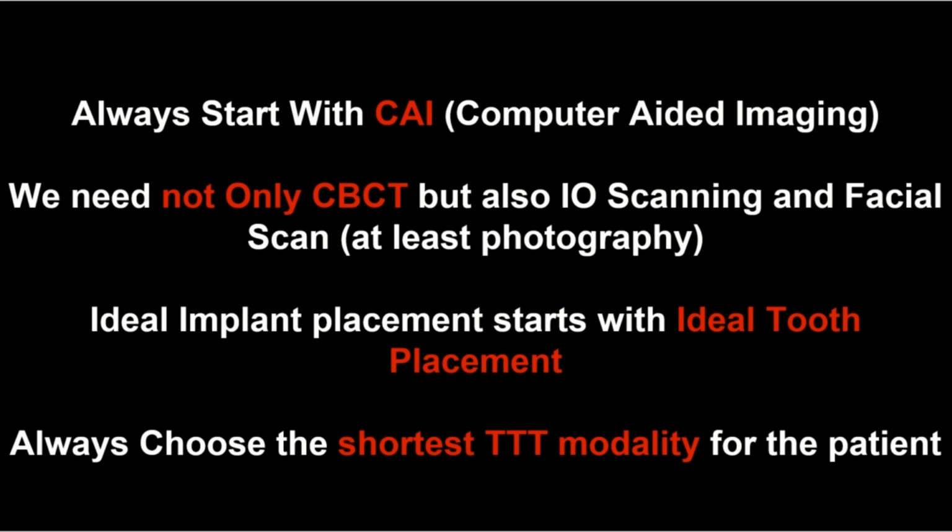As we all know, CBCT is the main tool for implant planning. But if we are seeking to provide our patient with a high-level restoration, CBCT is not enough. We have to transform our patient into a virtual patient, and that is called the CAI step, computer-aided imaging. Of course, CBCT can give us an idea about the bone, which is very important in implant planning and in the implant surgical procedure, but unfortunately not enough.